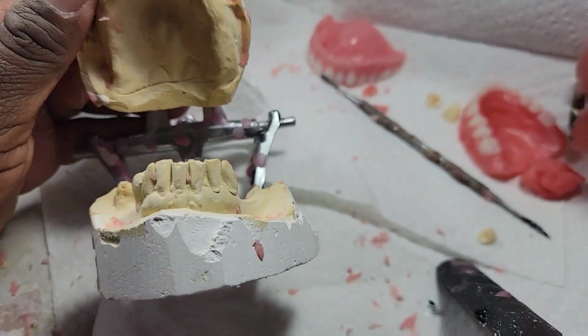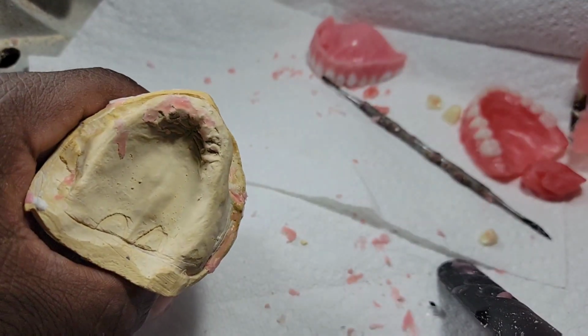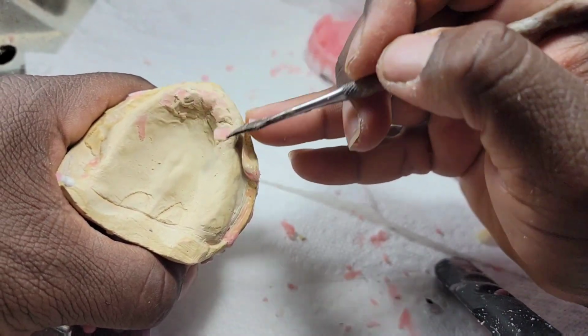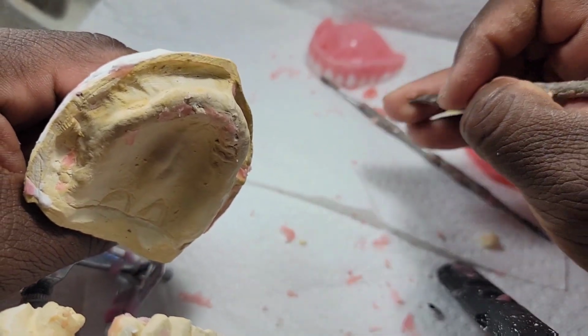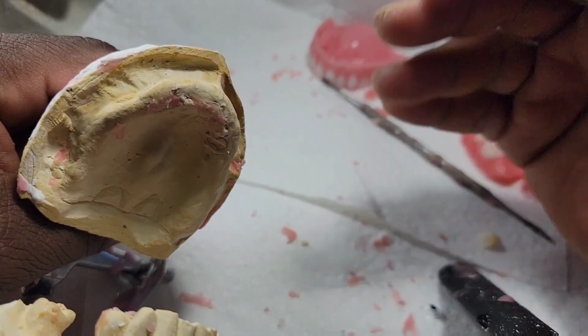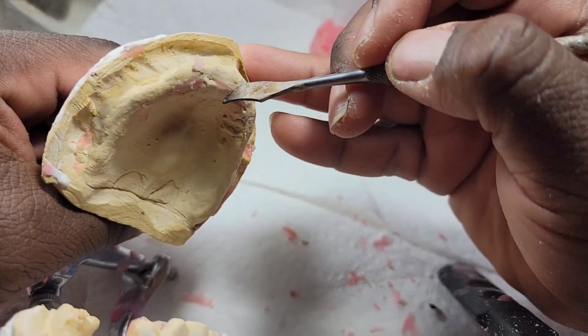Then also people want bigger teeth. We go by the size of the ridge when we make dentures, and by the facial shape, how your face looks, if it's circular, round, tapered, or square. That's how we pick teeth.